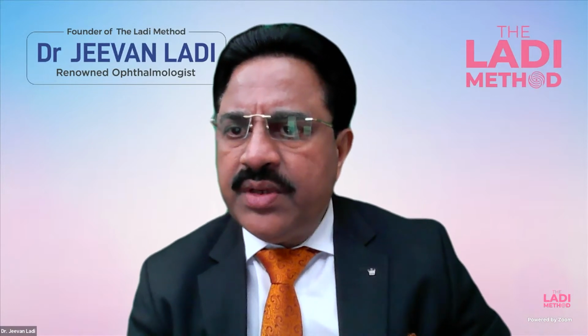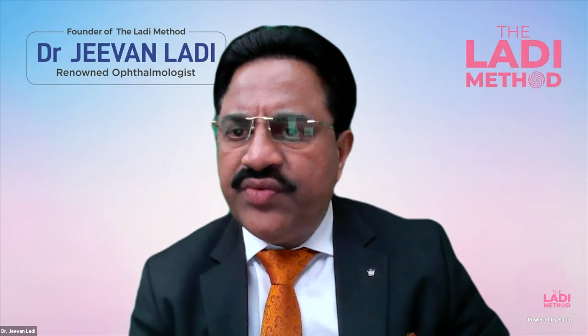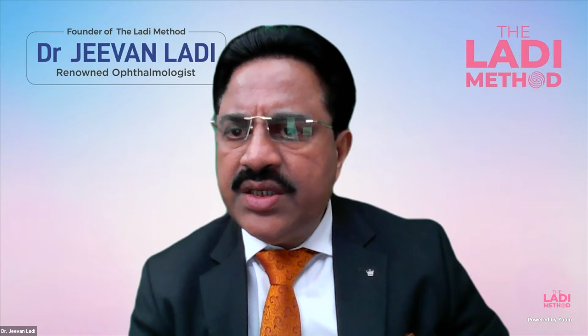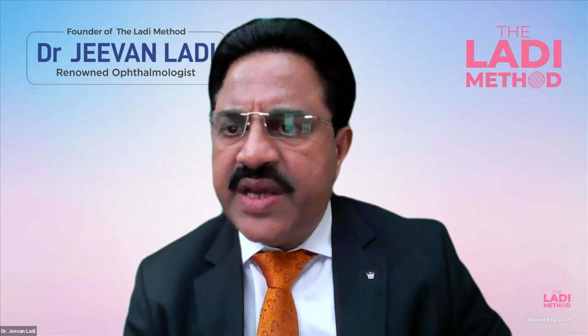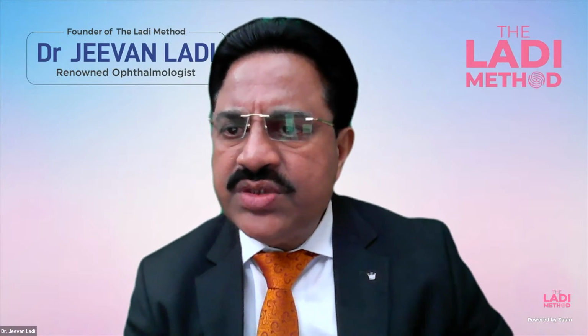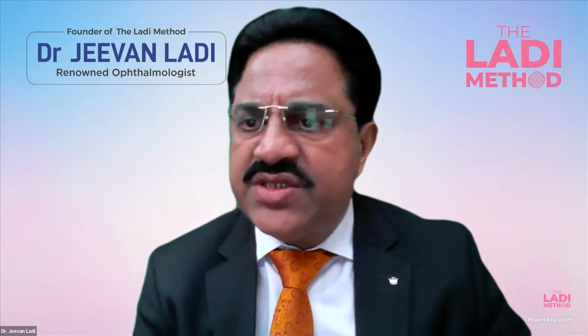There's a question from Dr. Narendra Singh Verma. What is the incision SIA value for a 2.8 clear corneal incision? Do you recommend MSICS incision or steep axis or OCCI to reduce the astigmatism? Incision location is on the anterior steep axis.